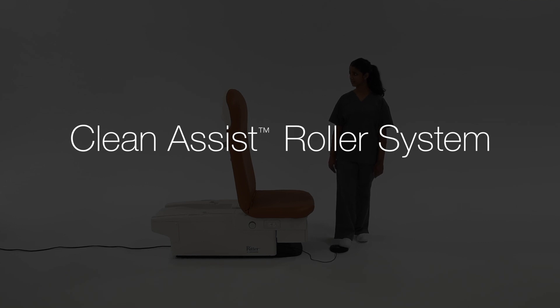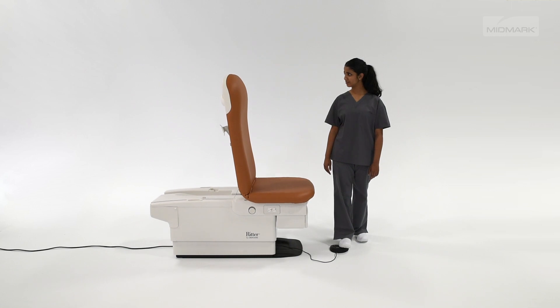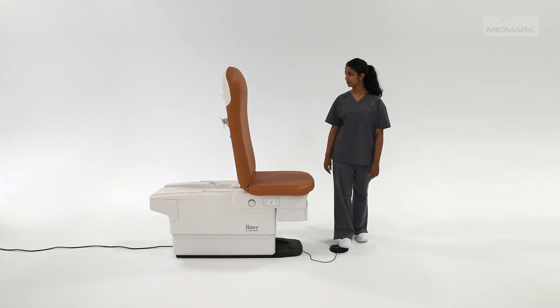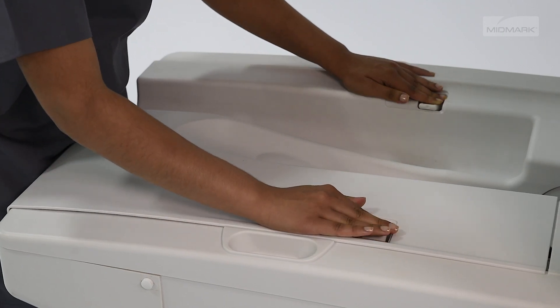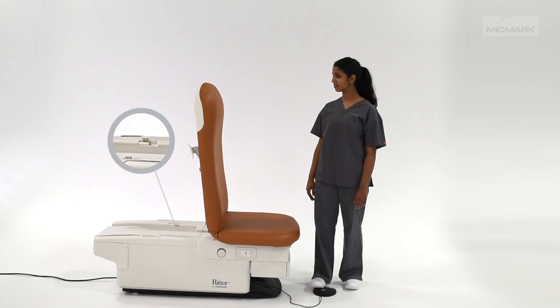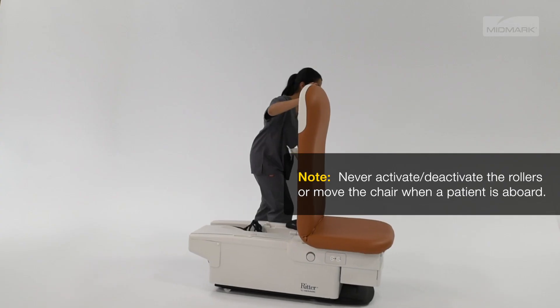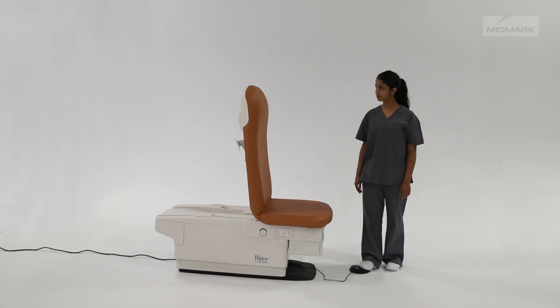To activate, raise the back section 30 to 45 degrees and ensure the chair is at least two inches from its lowest position. Move the control levers on each side of the chair to the rollers down position. Lower the chair to activate the rollers. Unplug the power cord and move the chair as needed. To deactivate, reconnect the power cord and raise the chair.